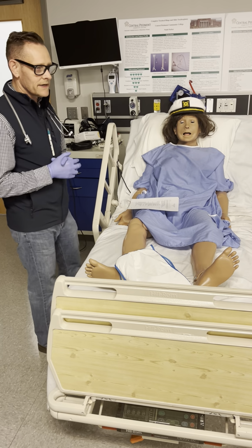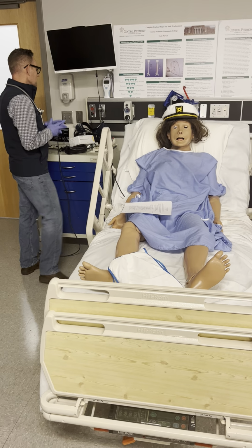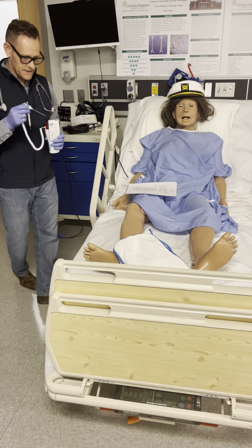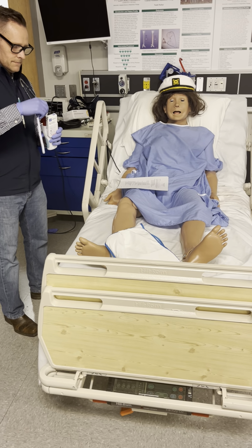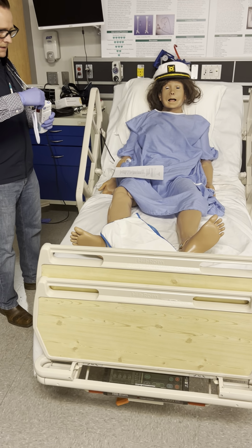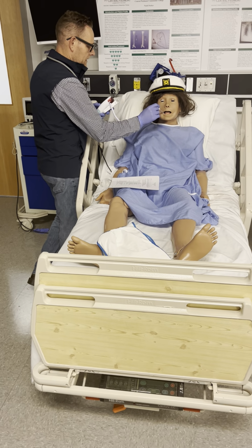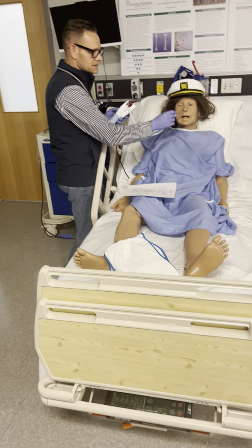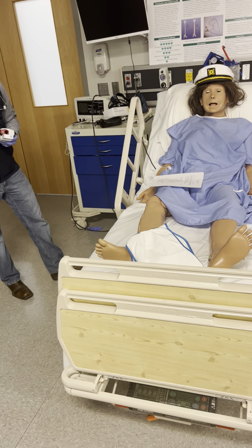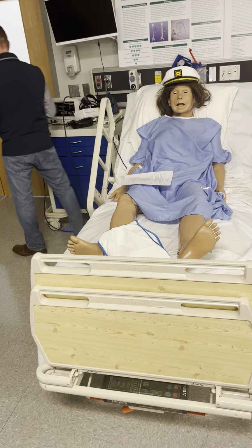Body temperature. So where's the number one place we measure temperature? Orally. And my oral temperature is right here. So what we do is we just grab this, I'm going to place it in here and grab a little sheath for it, and I'm going to place this under her tongue. And then in about 10 or 15 seconds, it's going to give me a temperature here. What's normal temperature? 98.6 or 37 degrees Celsius. Okay, so we got that. We're gonna chart that, and we're gonna dispose of this.